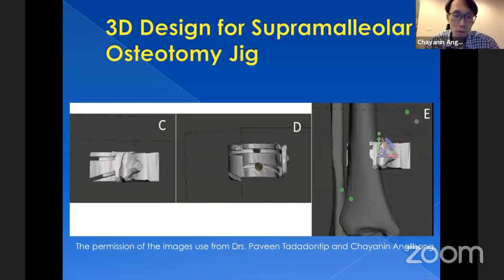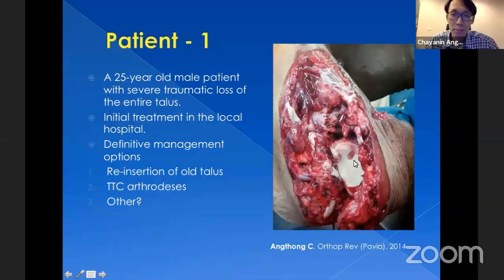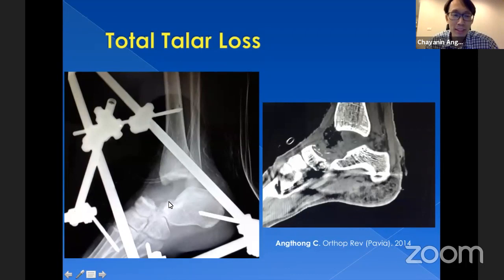Let's get to the case. A 25-year-old male patient with severe traumatic loss of the entire talus. Initial treatment was performed at the local hospital, including debridement and joint-spanning external fixation. You can see the tibial platform and a large open wound — he lost the talus from a traffic accident. For definitive treatment, the local hospital sent this patient to me. On X-ray, almost all the talus is gone, and the CT confirms this. He did not recover the talus from the road.